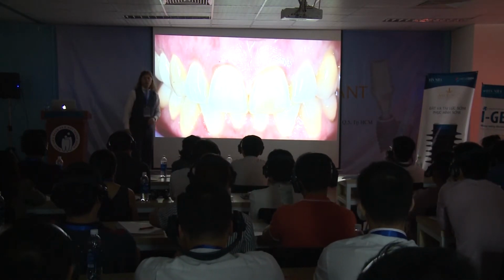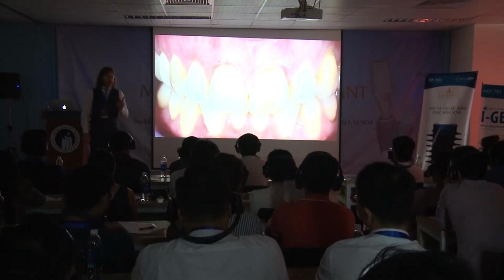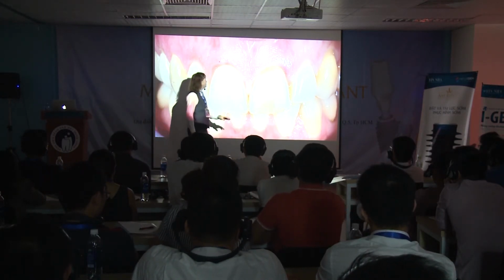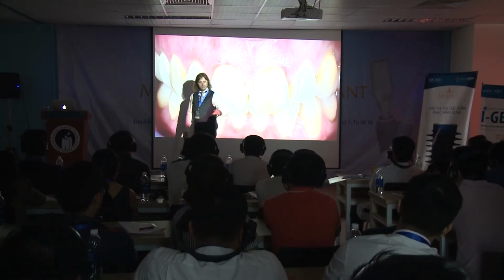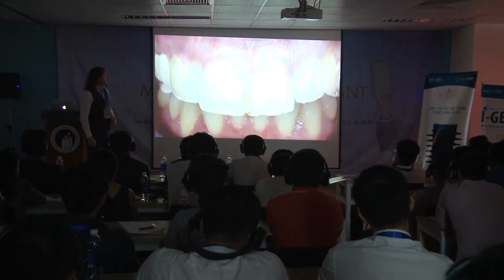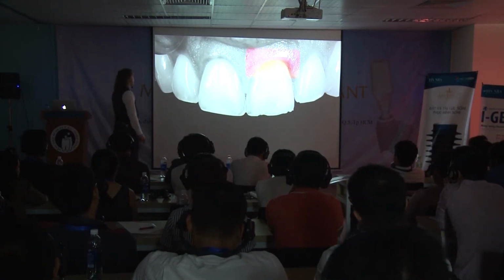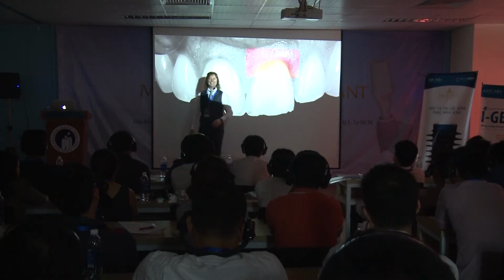This lady has a tooth broken. So I asked her for 3 days of chlorhexidine rinsing and hygienist. They prepared the mouth. This tooth is broken. And it's a very difficult case because the aesthetic is perfect, and she shows 100% while smiling.